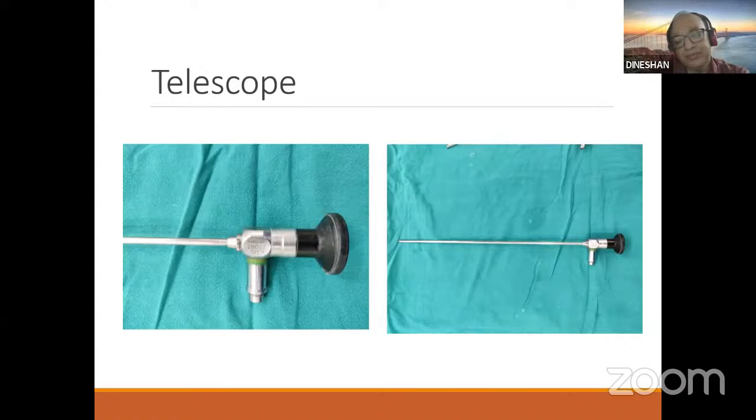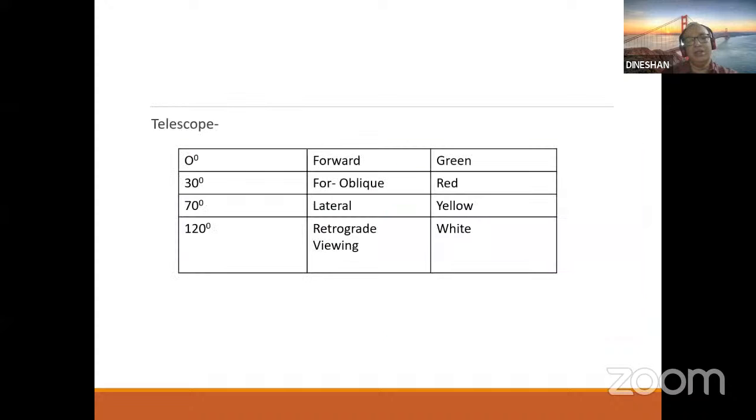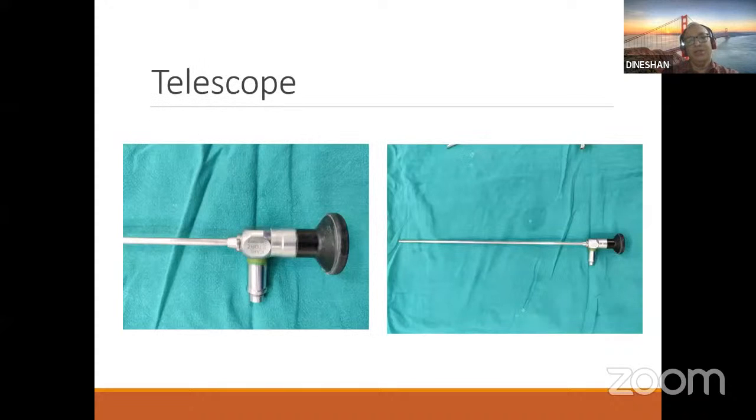And later on, with the introduction of the Hopkins system, the space in between the rod lens was acting as the lens. So that improved the clarity and the visibility and the image.